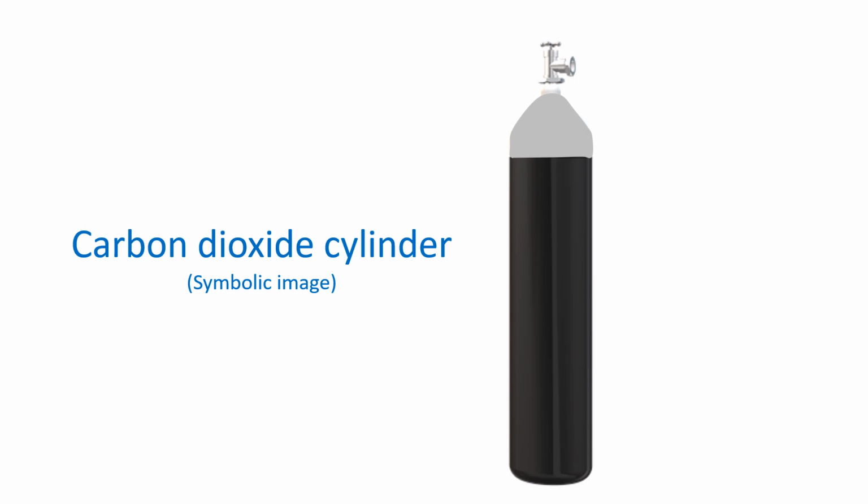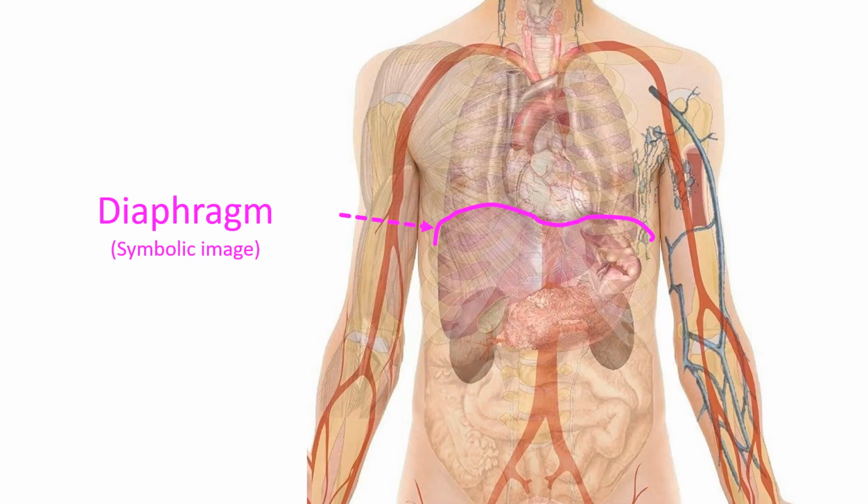But the technique of carbon dioxide angiography is a little cumbersome than usual contrast angiography. We need a medical grade carbon dioxide cylinder, 3-way stopcocks, connected tubings, syringes, and a reservoir bag for interim storage of carbon dioxide. Carbon dioxide angiography is an alternative in those with contrast allergy, as carbon dioxide is non-allergenic.